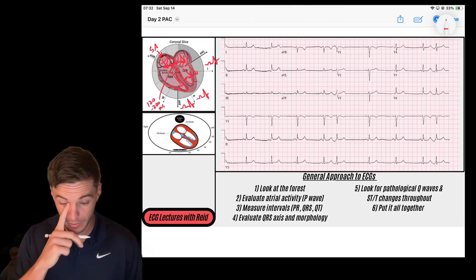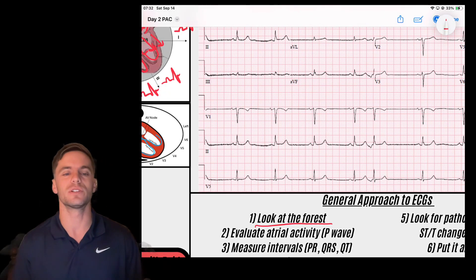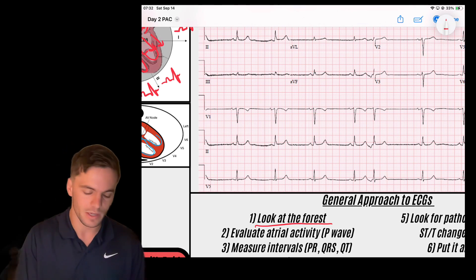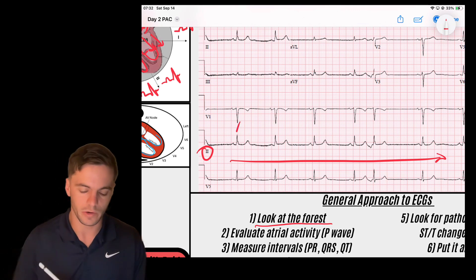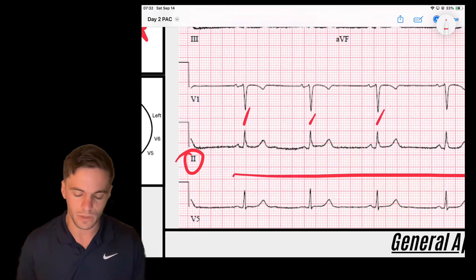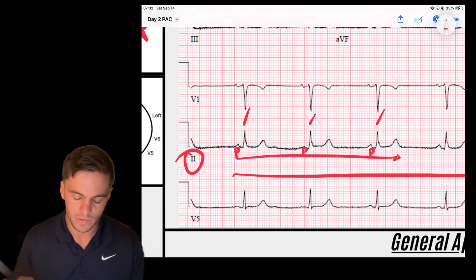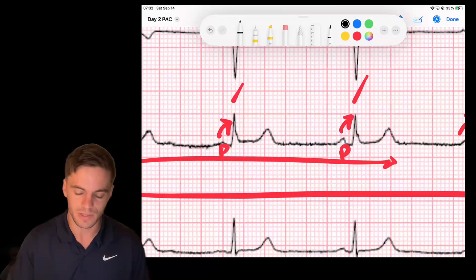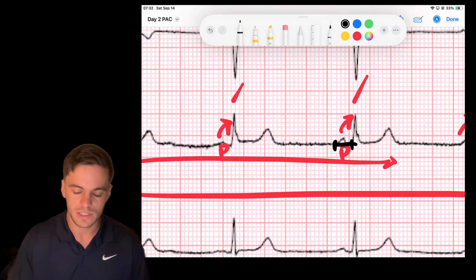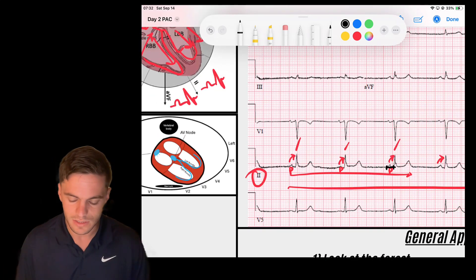When I look at this EKG, I'm going to look at the big picture first — getting an idea of what's going on with the rhythm. I pick a rhythm strip, maybe lead two, and look across it. It's a pretty regularly occurring rhythm. Zooming in, I can see P waves conducting nicely to QRS complexes with a PR interval that seems to be normal, around 120 to 200 milliseconds. Right now this looks like a nice sinus rhythm.